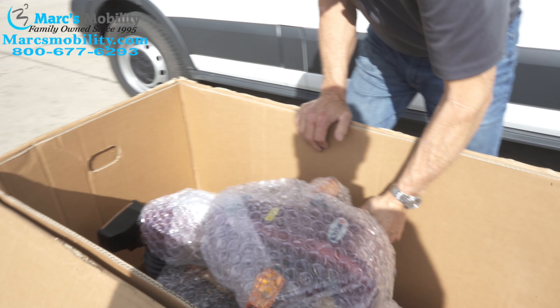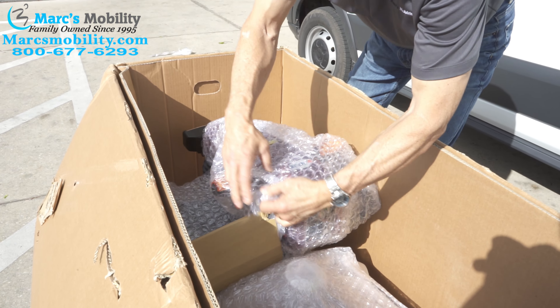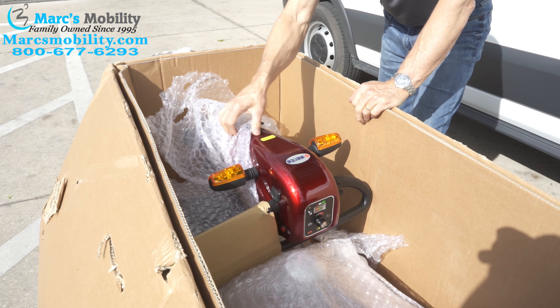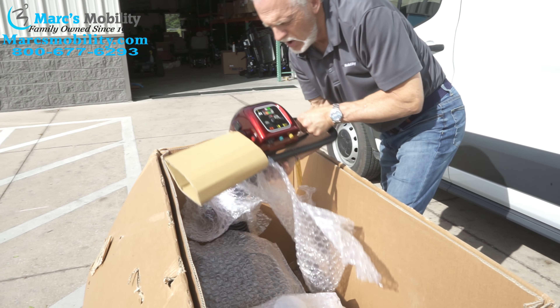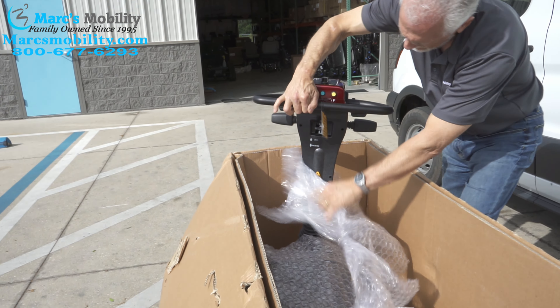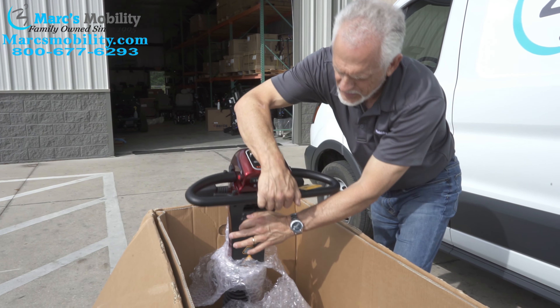You'll have to raise the tiller up on this scooter. You'll have to cut your plastic to get to the tiller. This is called the tiller. Right below the tiller, under here, there's a little arm — you can see it right here. When you push it down, you have to reach with the tiller down. It's a hard tiller to bring up. Reach down, push it down, and bring your tiller up.